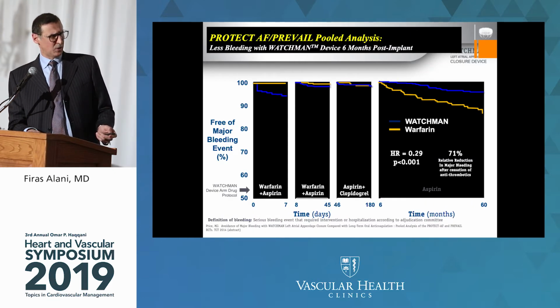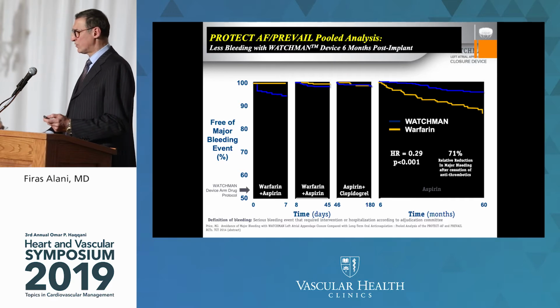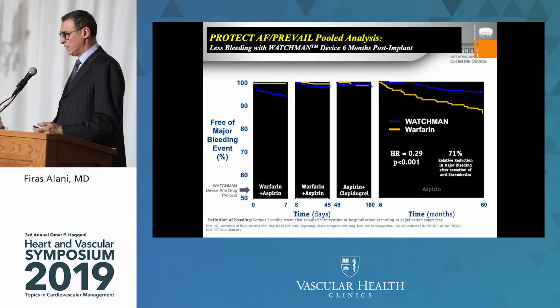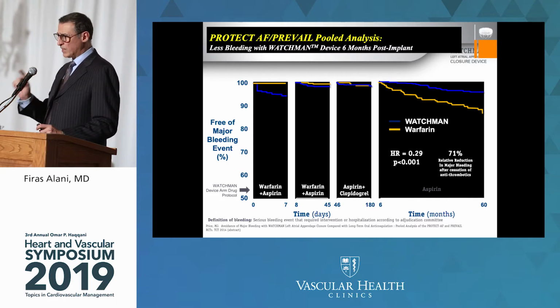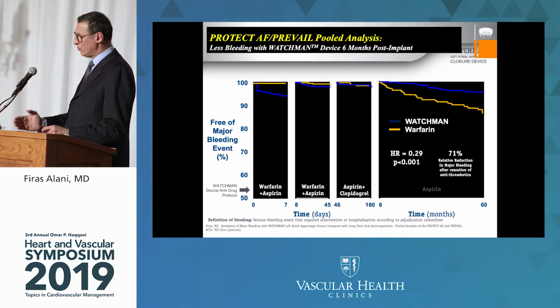In this trial, they looked at the PROTECT trial. You can see that these are the free from major bleeding events. This is where the device makes its impact. I could tell you the best day for our patients is when they come in on that 45 days. So we put the Watchman in on day 0, and they come back at 45 days.